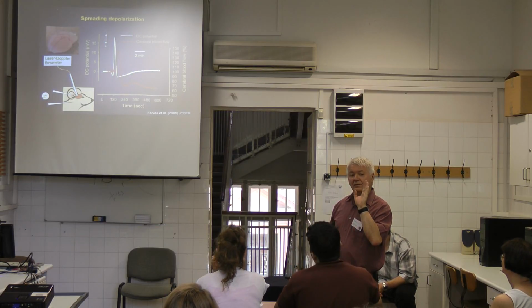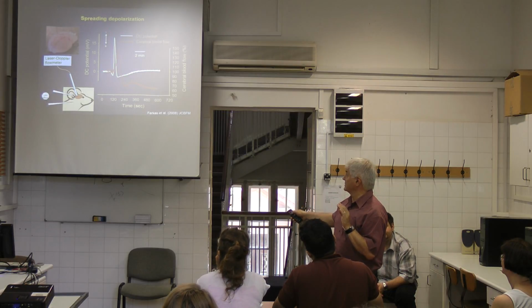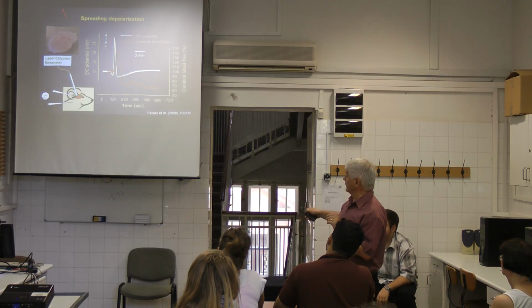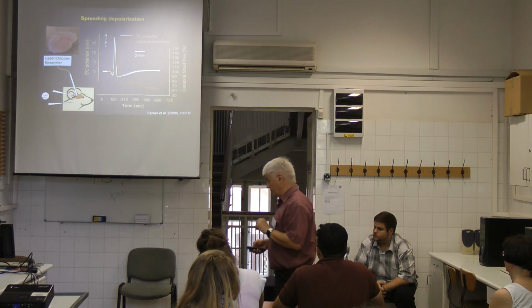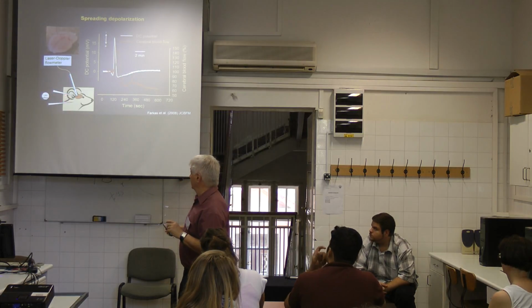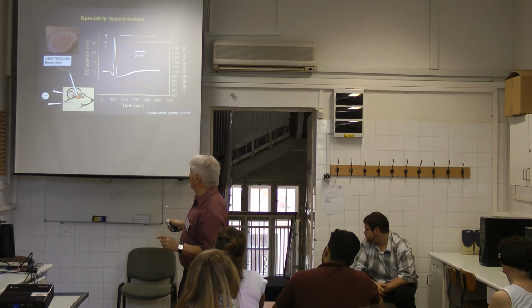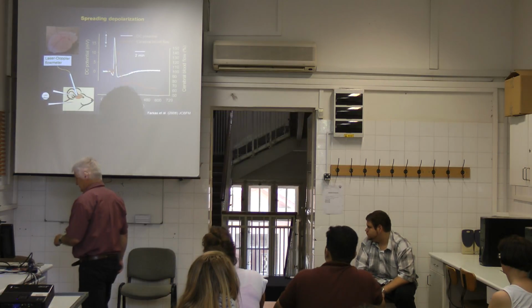Stimulate the whiskers, and there is a change in the local field potential because of active neurons, accompanied with local blood flow change. How is it? Check. Checking the DC potential with the amplifier and looking at the local blood flow with a laser probe.